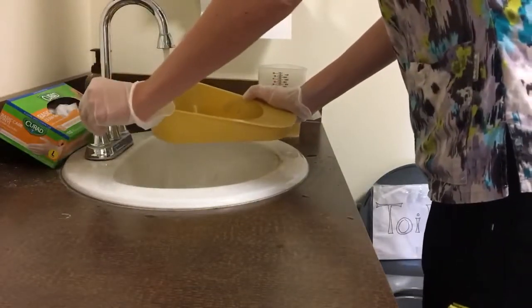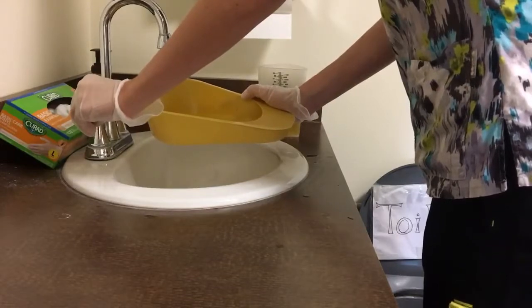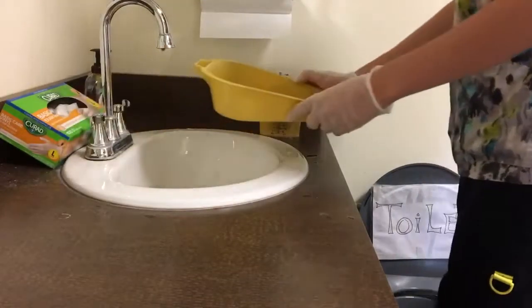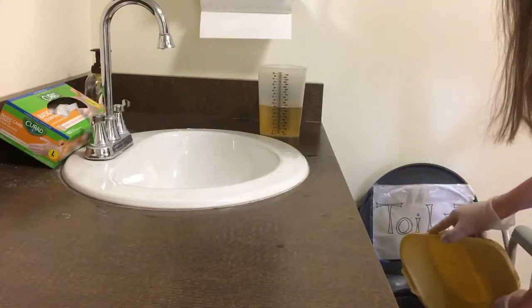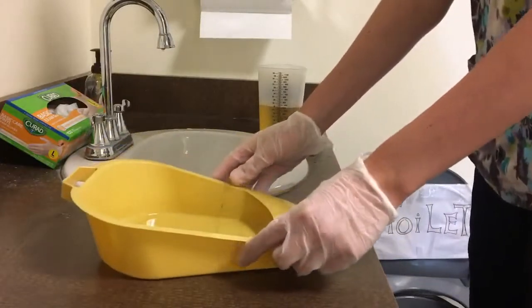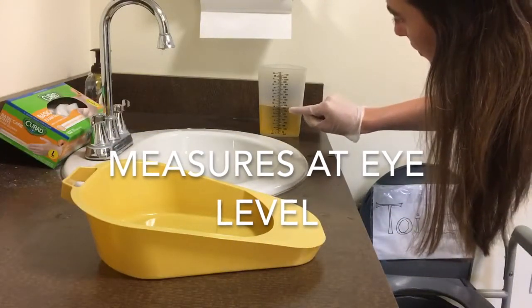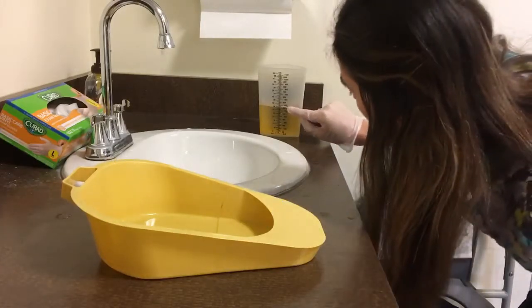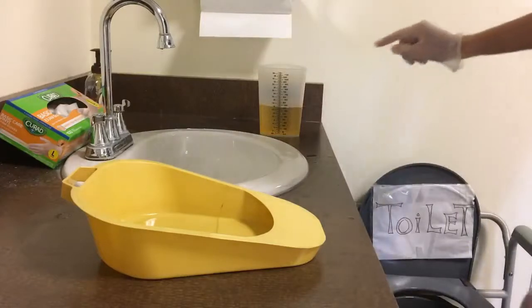Rinse the bedpan and pour the rinse into the toilet. Now measure the urinary output and round up to the nearest 25 ml if needed.